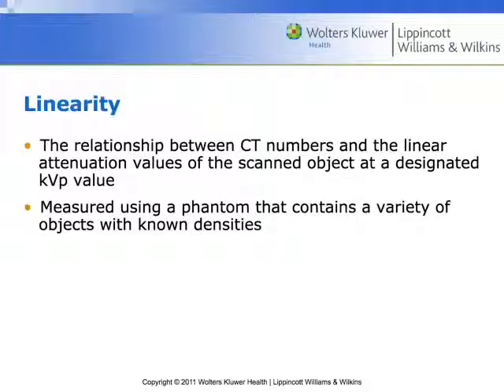Since they can specifically say this is what it's constructed of, this is what its Hounsfield unit measurement should be, we are going to scan that cube and then we're going to measure it, and we want to see a number that's exactly what the physicist predicted. Okay? So they'll have a variety of objects with different densities. We'll place ROIs on them and make sure that those Hounsfield units correspond with what the physicist said.